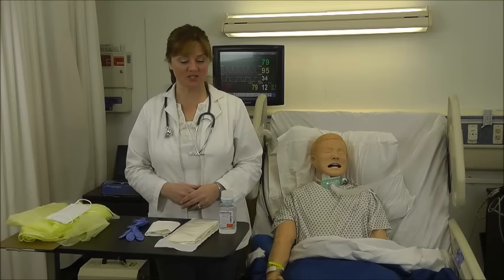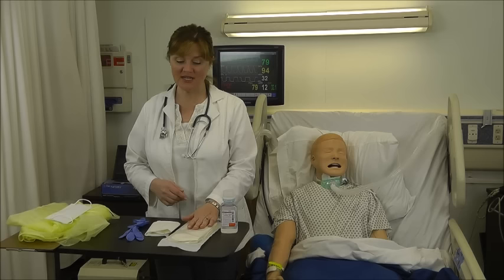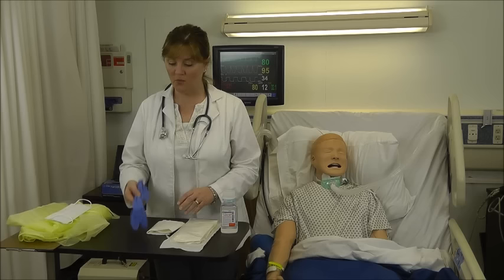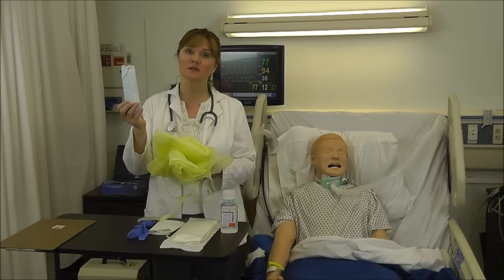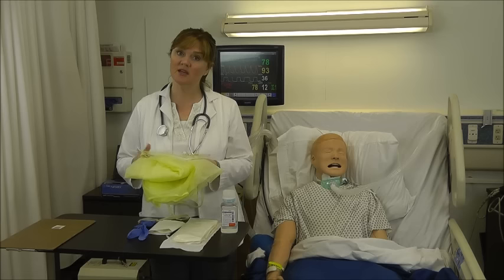For tracheostomy suctioning, you need a bottle of normal saline, a trach suction kit, a non-sterile drape to lay across your patient's chest to protect it from the secretions, one clean glove for testing the suction tubing, and personal protective equipment to protect you from secretions. This could include a gown, a mask with eye shield, or a mask and a pair of goggles. I'm going to set these to the side for demonstration purposes, but make sure that you think about protecting yourself when you're performing trach suctioning.